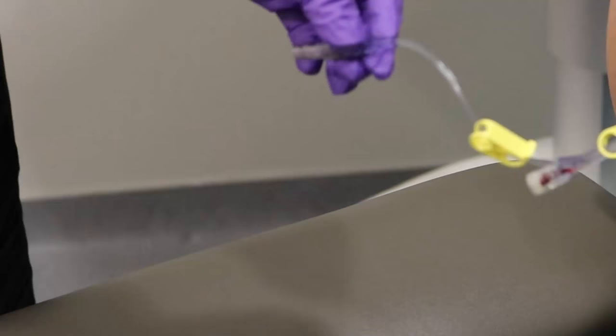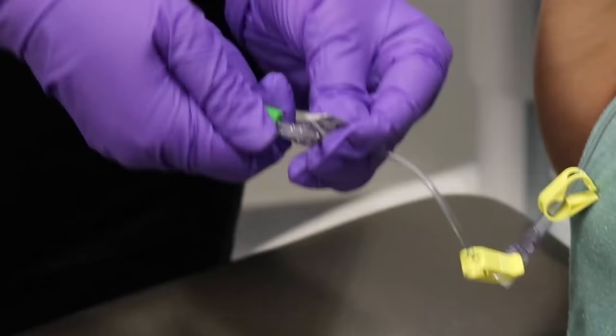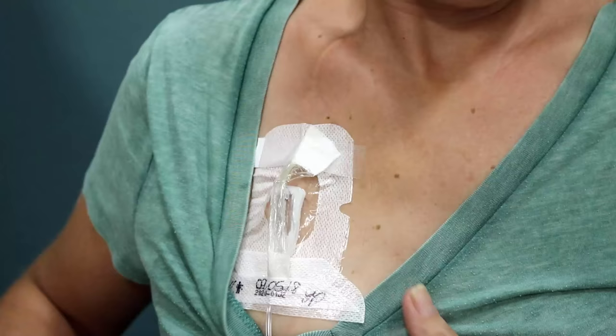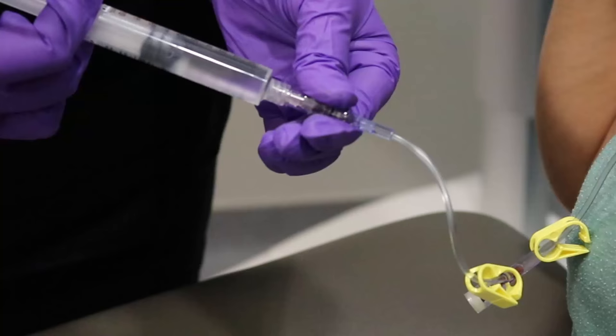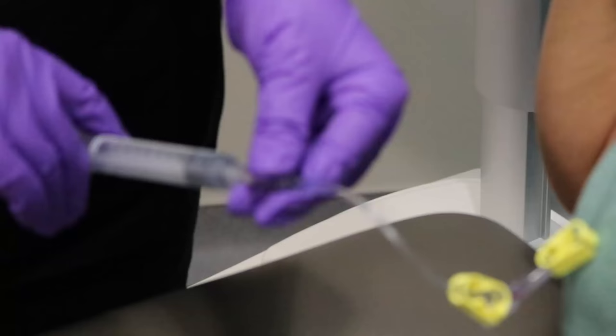Flushing the port helps keep the line patent, meaning open and unblocked. If necessary, the port needle can remain in place for seven days with a secure dressing covering it. Your nurse will instruct you on how to care for the area if the needle remains in place. To maintain patency of the port, it should be flushed with normal saline every four to six weeks.